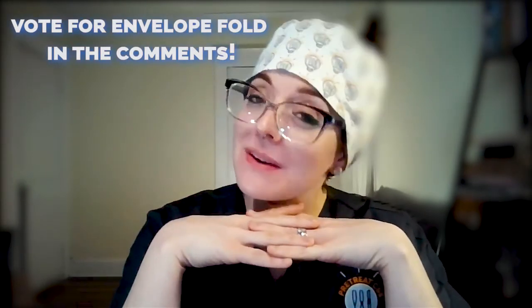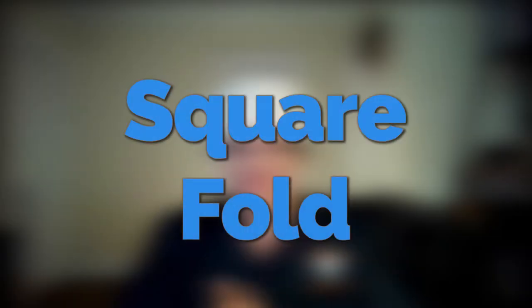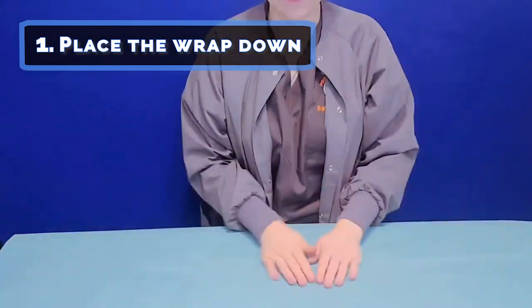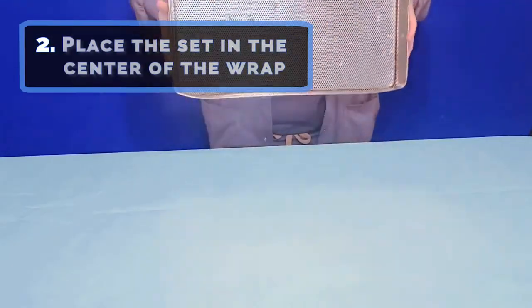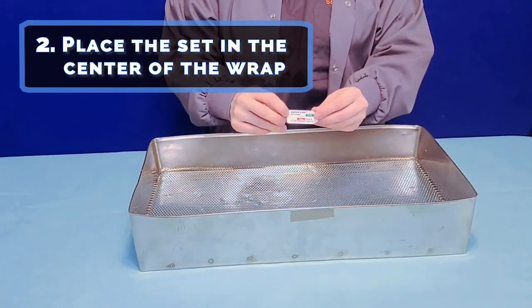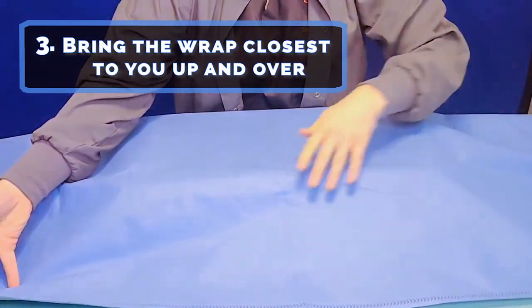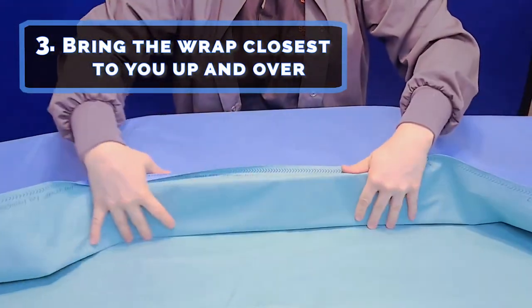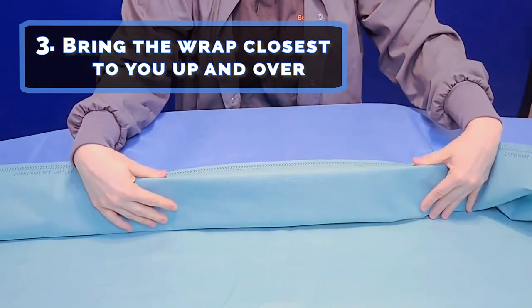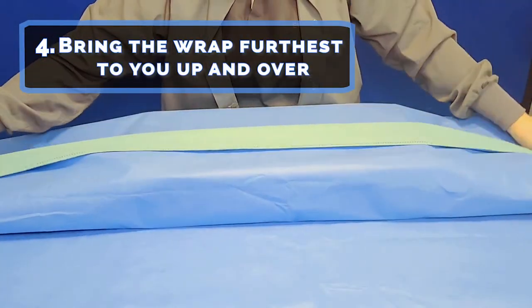Envelope fold is looking pretty nice. Let's see what square fold is bringing to the sterility table. 1. Place the wrap down so that it looks like a square. 2. Place the set in the center of the wrap. Check with your facility to determine if corner protectors are needed, and don't forget your integrator. 3. Bring your wrap closest to you up and over, completely covering the side of the set, and make a tab. This is crucial for aseptic technique. 4. Bring the wrap furthest from you up and over towards you, leaving a tab.